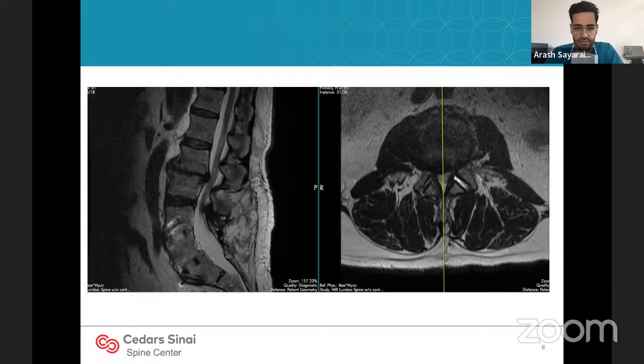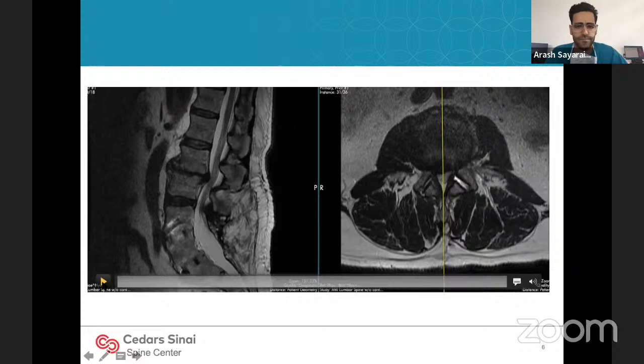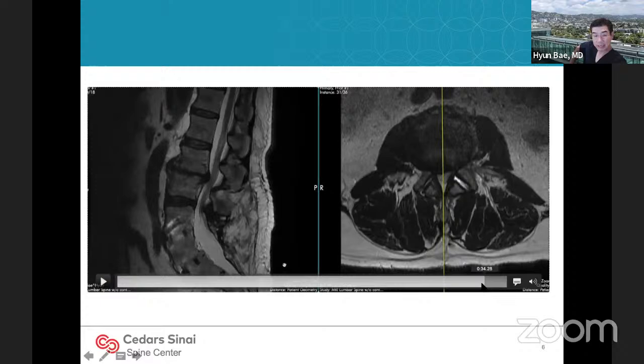And you can see a post-laminectomy phenomenon. He's got scar tissue all the way in the lower lumbar spine. This is a typical case because obviously he's got a little fluid in the facets. He's got central stenosis, lateral recess stenosis. And I think the first thought for me was, hey, it's a fusion, right? It's an L2-3 fusion. Pretty simple. He's got hardware in the back.